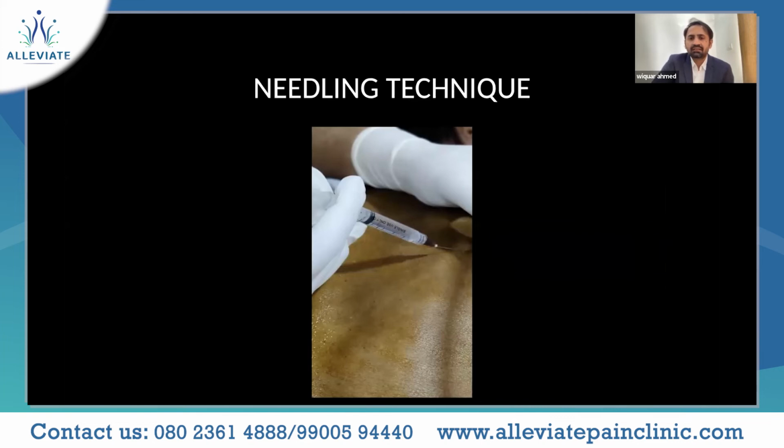When we are doing our needling technique, it's also very important for us to know that the needle may be bent, just like how we bend our needles for our fluoroscopy guided techniques. It's important that we bend our needles a little, because the concept is that when our probe is there, especially your linear probe, you need to keep the footprint of your linear probe and your needle parallel to each other. Sometimes it becomes easier for visualization. This was a scapulothoracic bursa, in which it becomes easy, because that area is important for manipulation. It was just an added extra point. So hope it was helpful, and thank you.